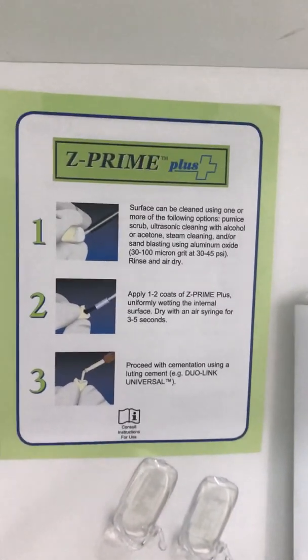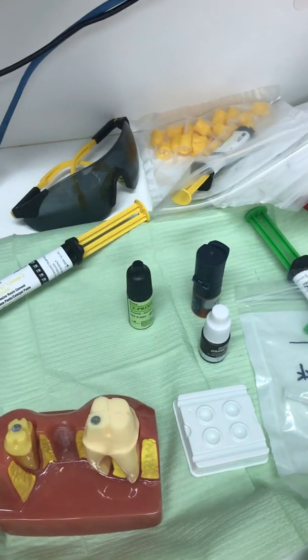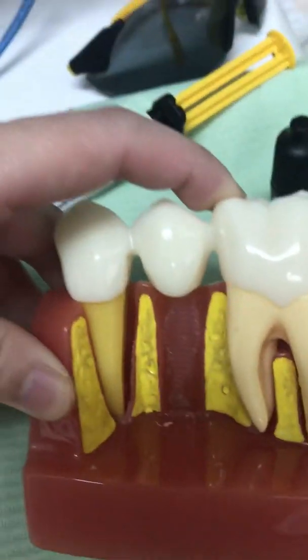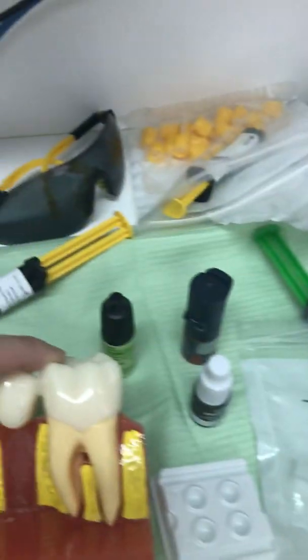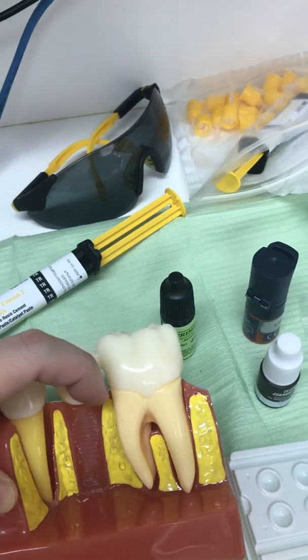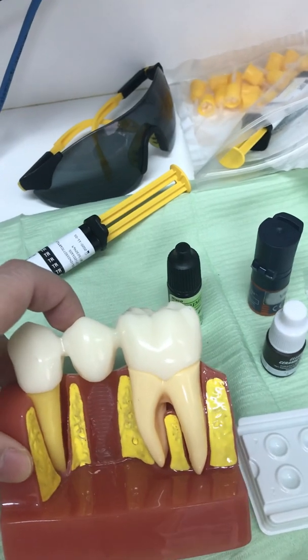We then proceed with putting Rely X Ultimate cement inside the crown. Once the crown is loaded with cement, it is placed onto the tooth and you need to hold it for six minutes. During those six minutes, we use floss to clean between the teeth and a micro brush to clean around the crown.